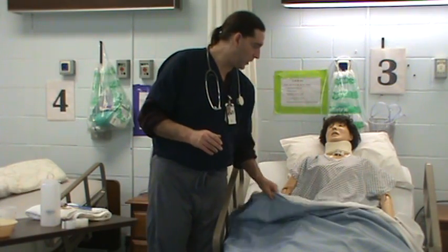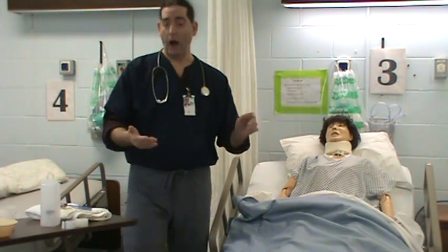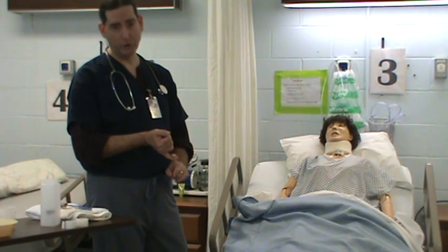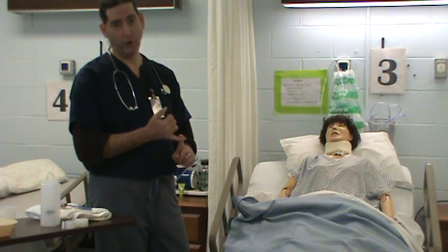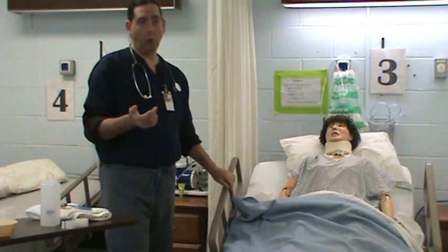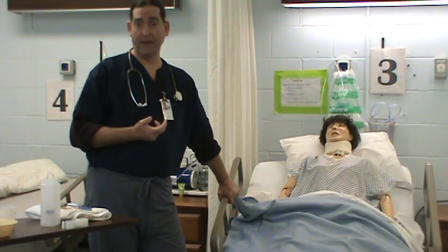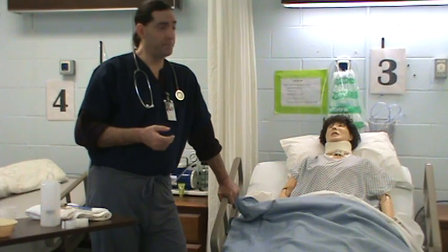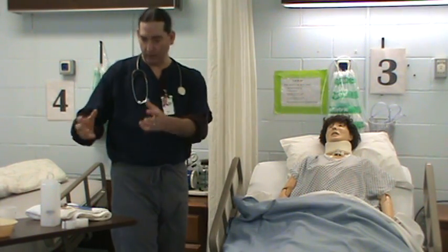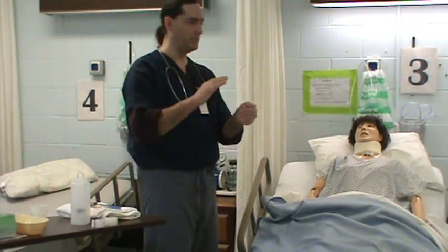To get things started, I'm going to do what you've got to do before every patient: check an order, because you don't want to put an NG tube down on the wrong patient — that would probably get you into a lot of trouble with your employer. So I'll check my order to place the NG tube. Then I'm going to gather my supplies, bring them in the room, hit my hand sanitizer, and wash my hands.